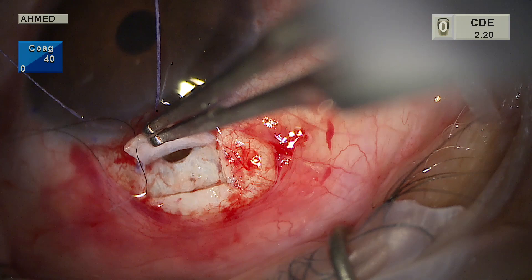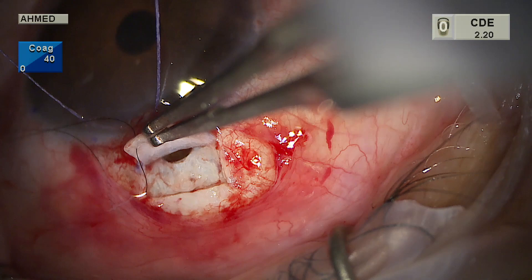The specimen shows the trabecular meshwork nicely, and the ostomy is shown here, relatively anterior to the radial incisions.